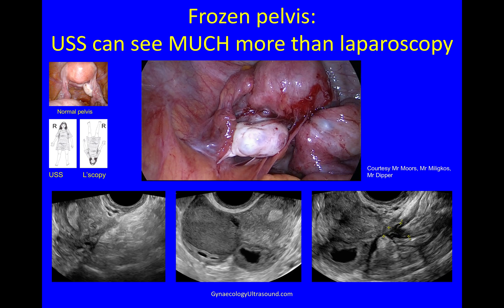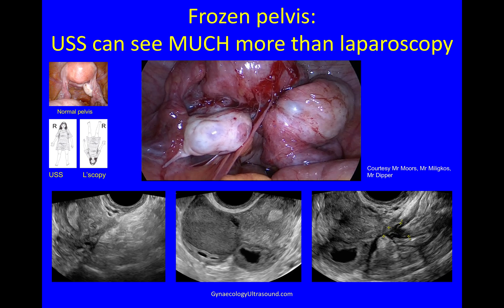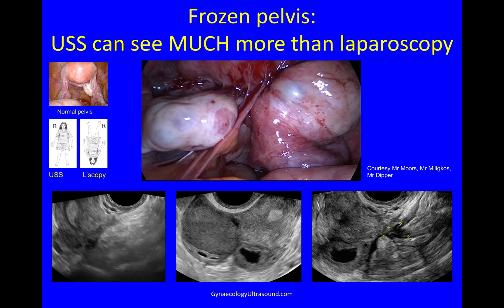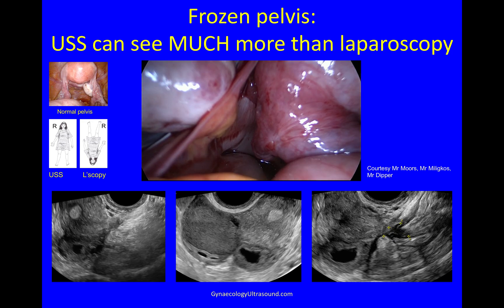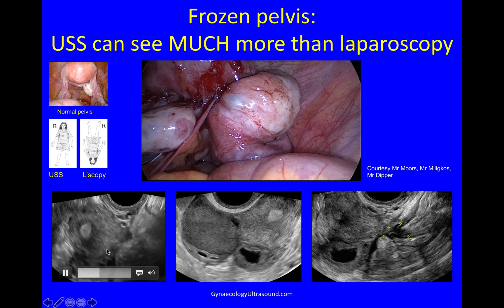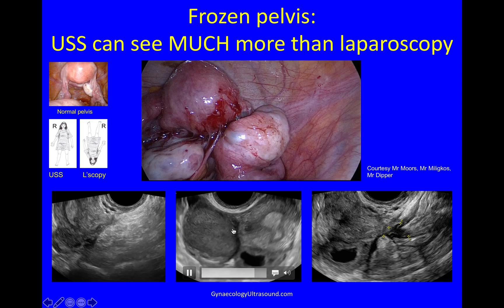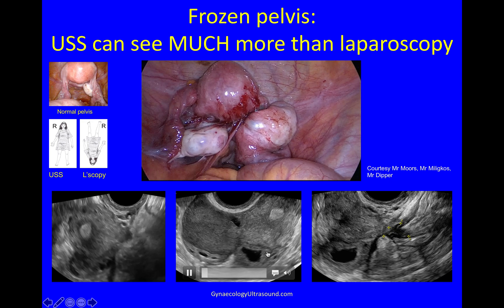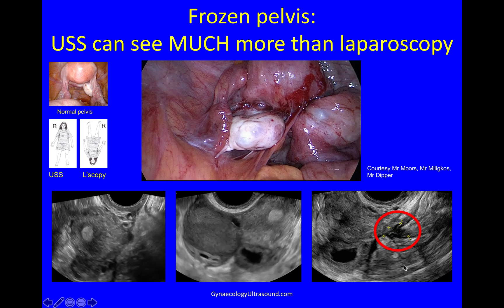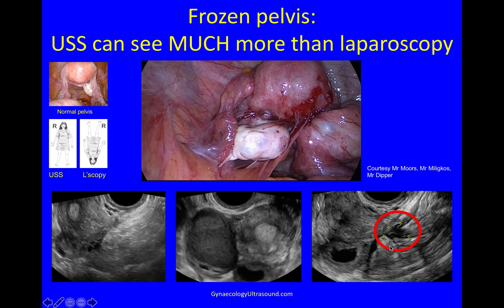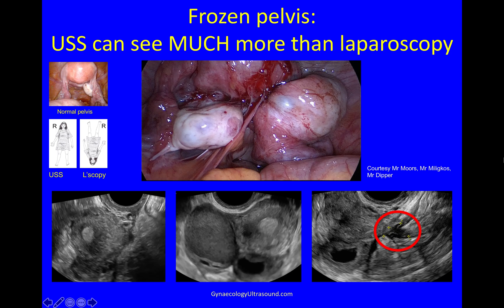This is an example of a patient with a frozen pelvis, to demonstrate how much more you can see on ultrasound than at laparoscopy. At ultrasound, we knew that the pelvis was frozen, we knew that she had a right ovarian endometrioma with adhesions of both ovaries to the back of the uterus, but also that she had a bowel nodule — and that was not obvious at diagnostic laparoscopy.